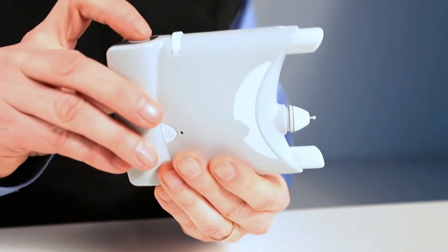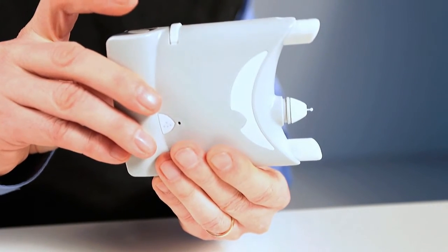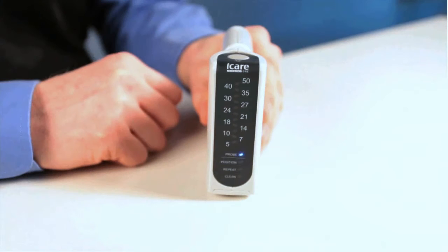Press the measurement button once to activate the inserted probe. Once the probe is activated, the probe LED remains lit. The tonometer is now ready to take a measurement.